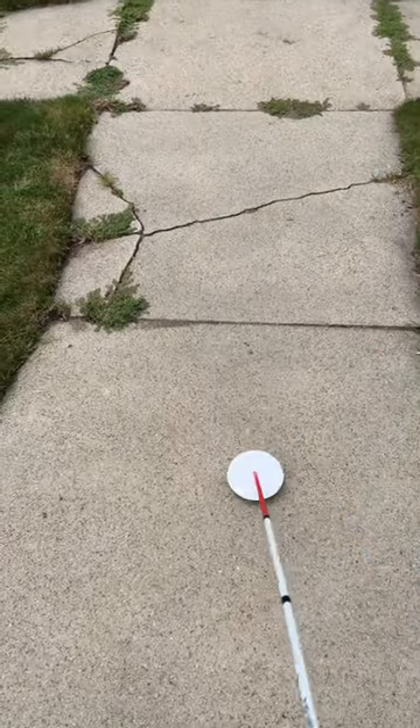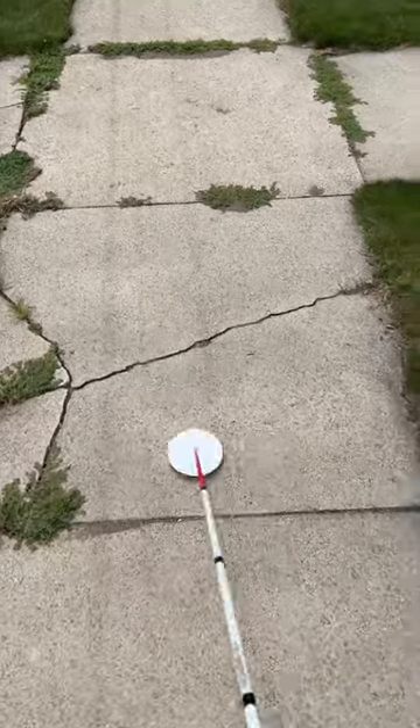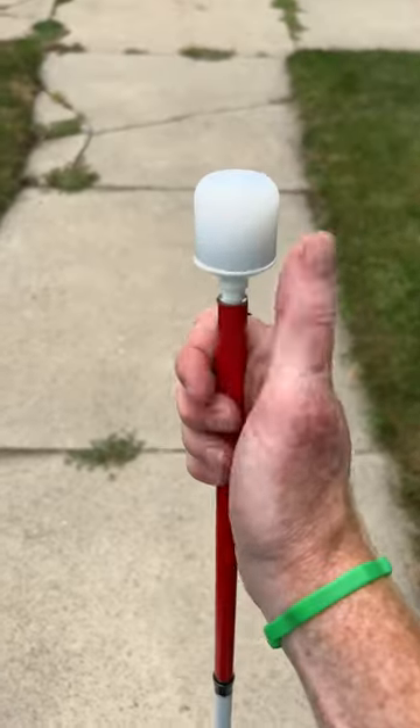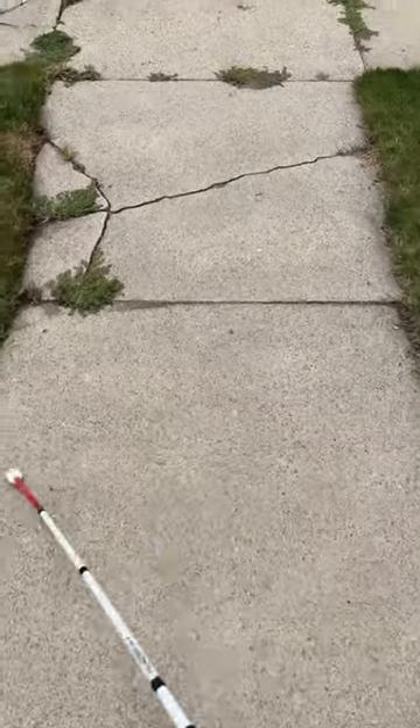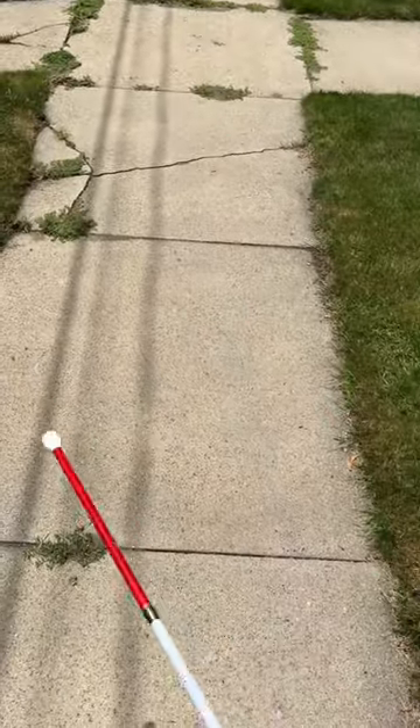Next here is the dakota disc cane tip. This one is a marshmallow roller cane tip. Here we have a marshmallow cane tip.